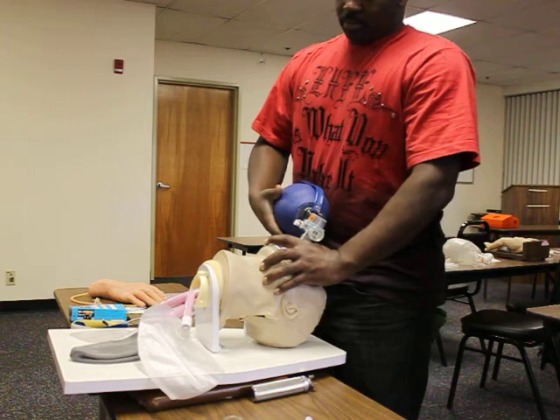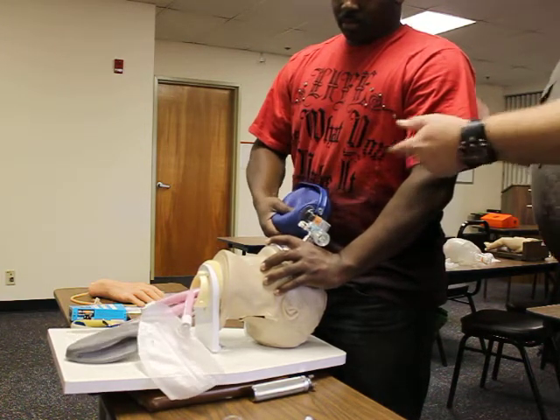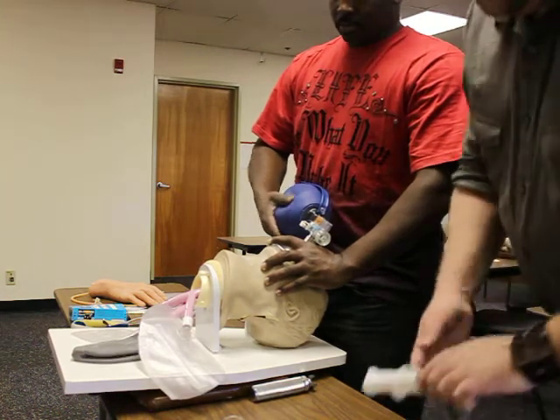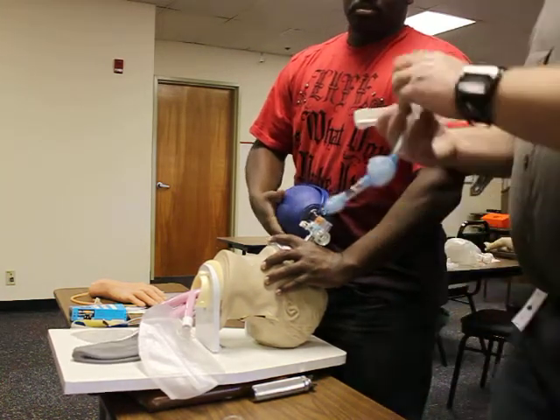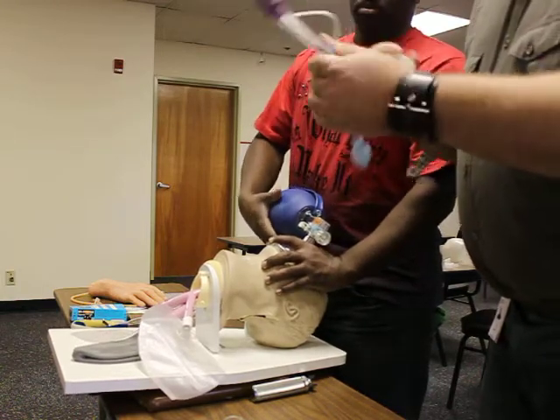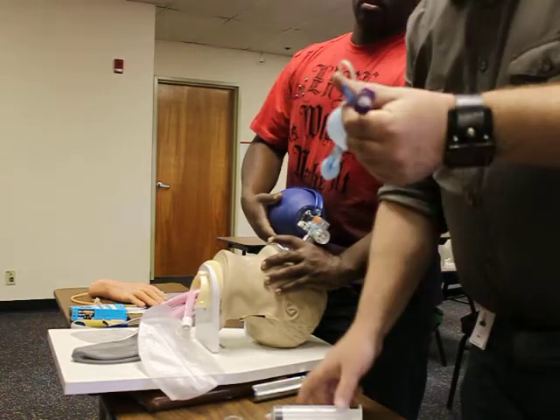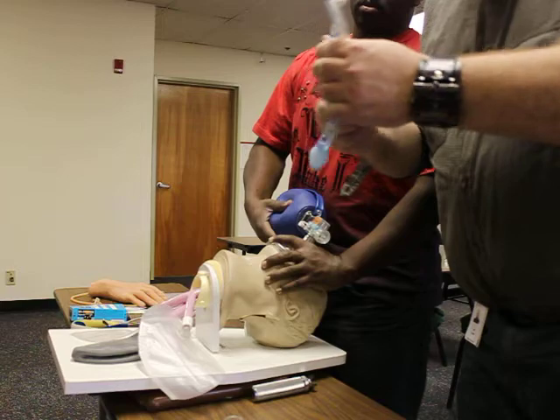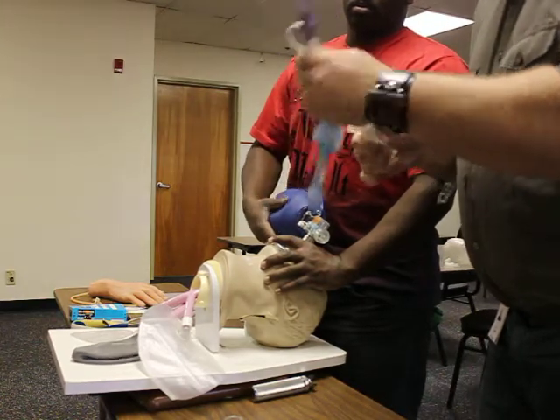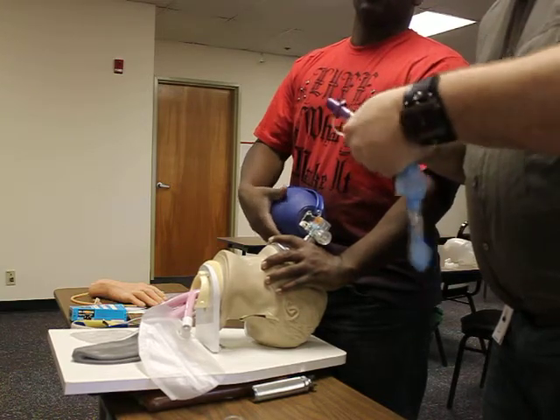Medical direction has ordered the insertion of a supraglottic airway. Solomon, would you go ahead and pre-oxygenate the patient, please — one breath every three seconds. I'm going to go ahead and test my equipment for my King Airway while he's doing that. I'm going to inflate my cuffs — there is no leak, they both look good. I'm going to withdraw my air. Now I'm set up and ready to go.